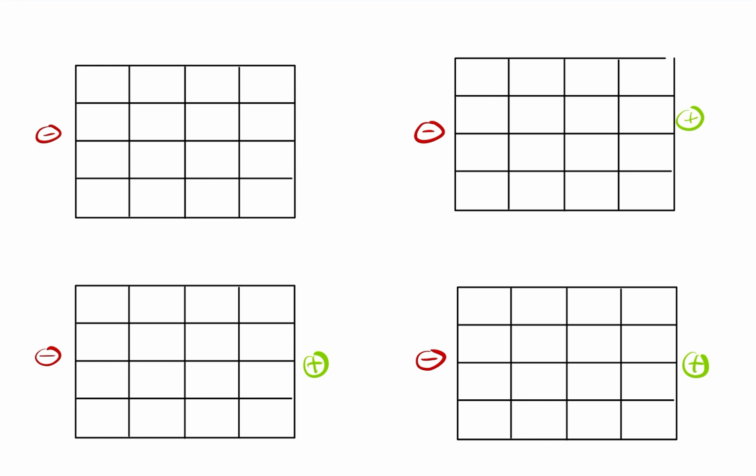Now we've got the frames here. They represent the cardiomyocytes, the cells of the heart, and the action potential that the specialized cells generate in our heart. We also place some electrodes on the surface of the human body, right? Because we are measuring what's outside.